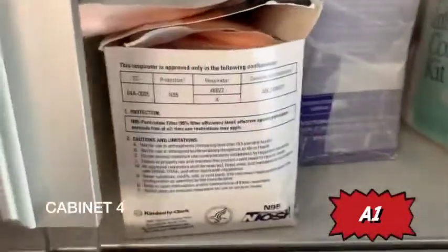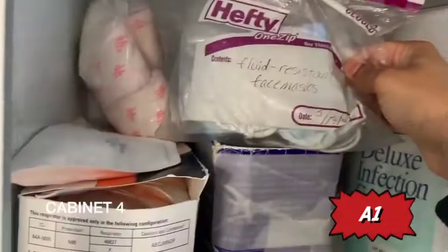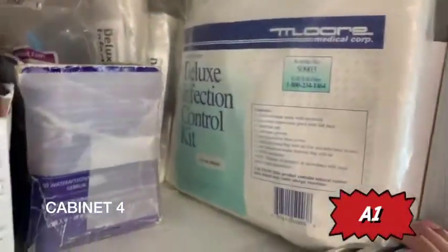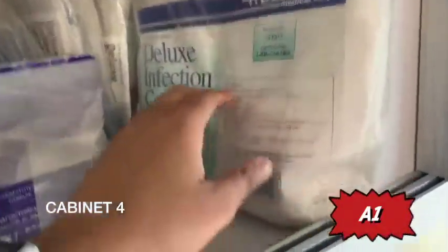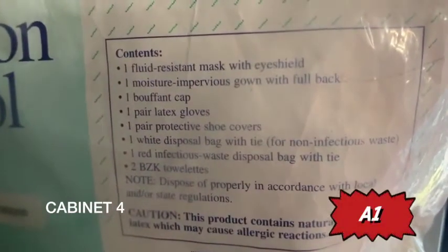Moving on, you have your N95 masks, fluid-resistant face masks, sanitary pads, and infectious control kits. These are new additions to the rig due to the recent pandemic. This is what's inside if we were to get a case with suspected or confirmed coronavirus.